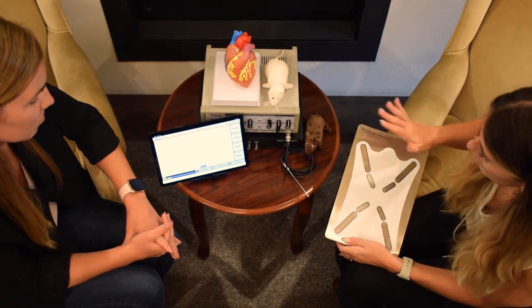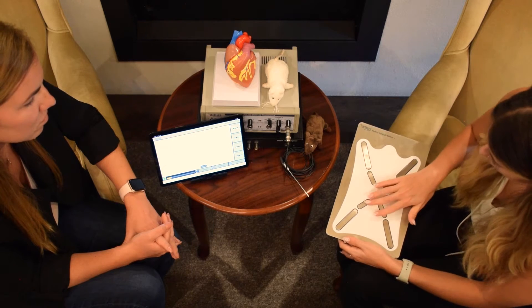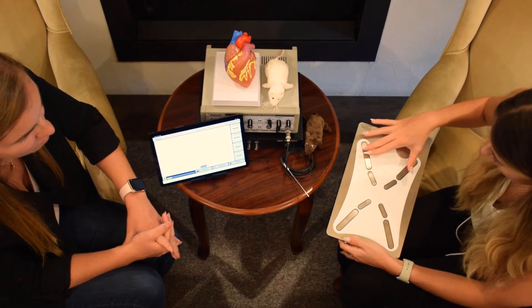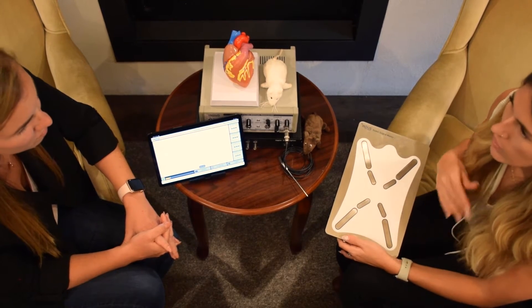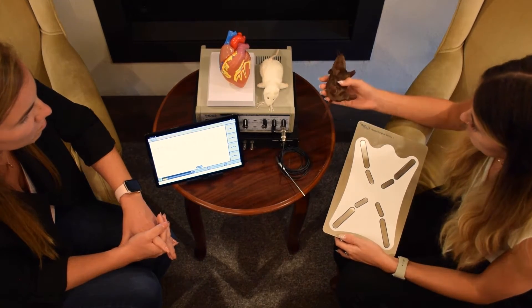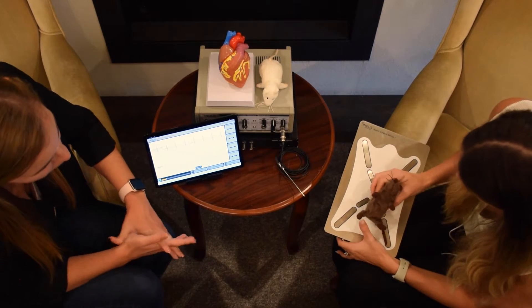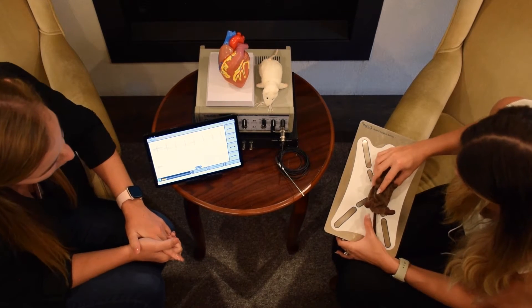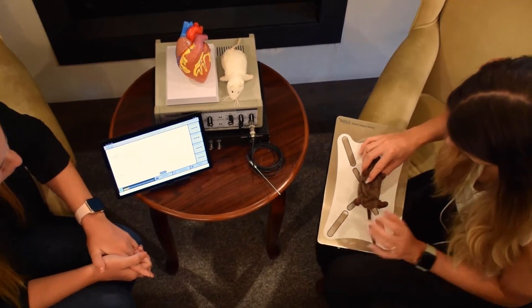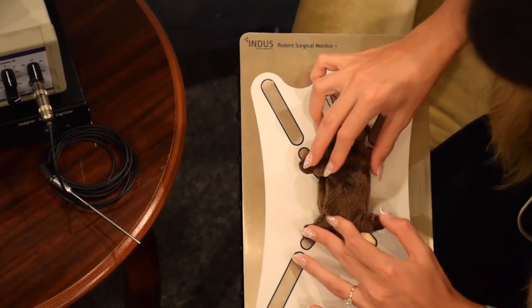We do that through the rodent surgical monitor here. We have four sets of electrodes — four for the mouse and four for the rat, though other small animal models work as well. The way we normally do it is we take our animal model and tape their paws down to these electrodes. It's completely non-invasive — all you need is a little bit of ECG cream.